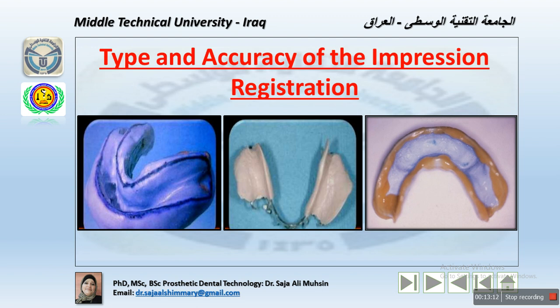Many researchers, for example, recognize the need to record the tissues that support a distal extension removable partial denture base in their functional form or supporting state, and then relate them to the remainder of the arch by means of a secondary impression. Of course, this was called a functional impression because it recorded the ridge relation under simulated function.